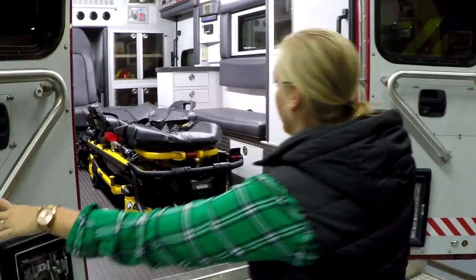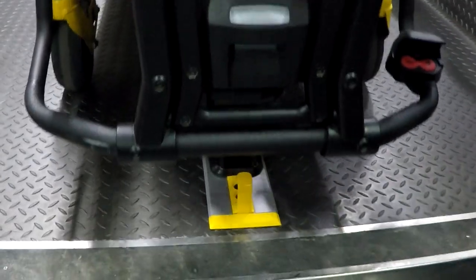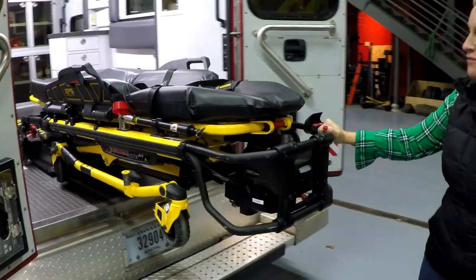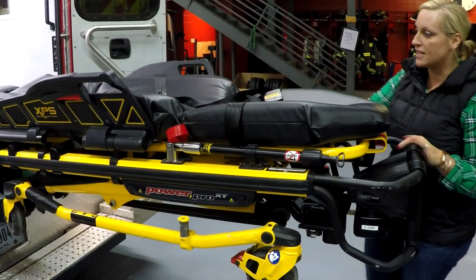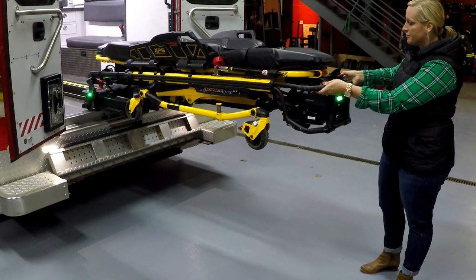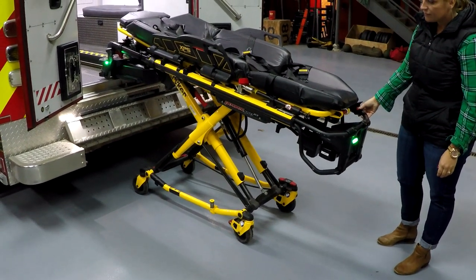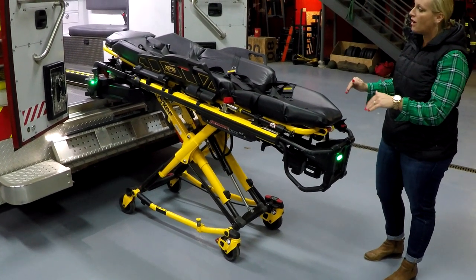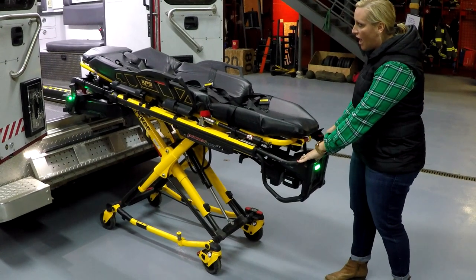Starting out with the power load cot in the locked position, you press the red lever right here. The cot jogs up to let you know it just took on the full weight of the cot and your patient. You guide it out until it stops — you get green lights on the trolley. Hold down the plus button. The legs of the cot come down first. Once all four wheels are on the ground, the arms of the power load system will come down. In this position, you're still locked in.